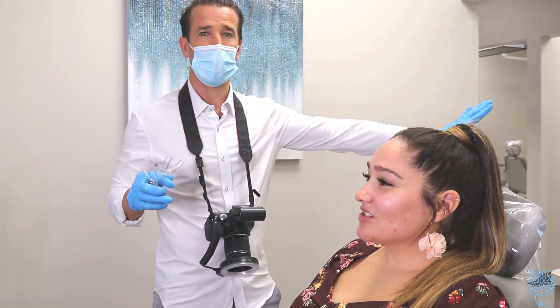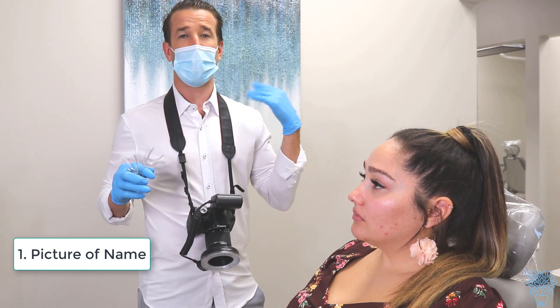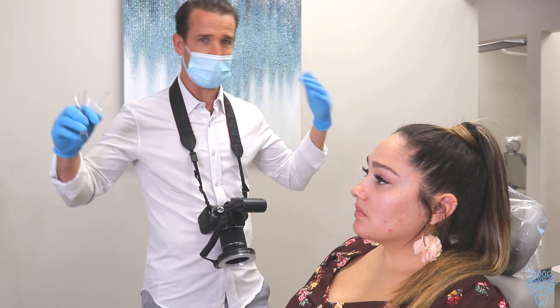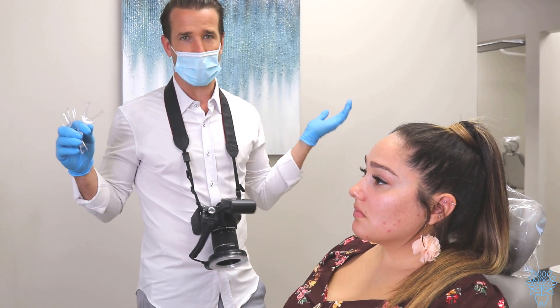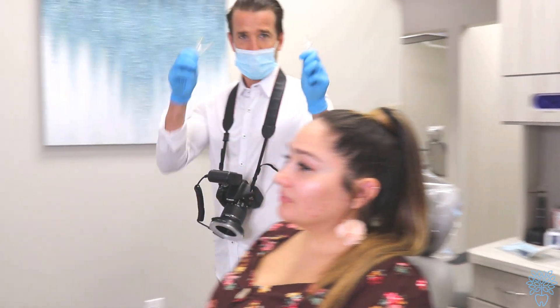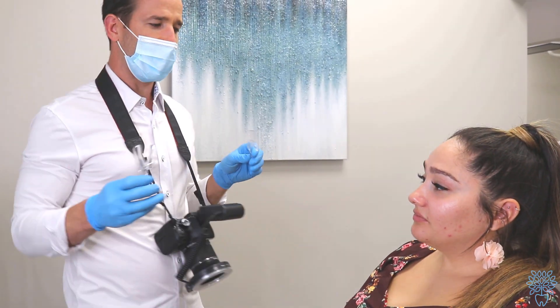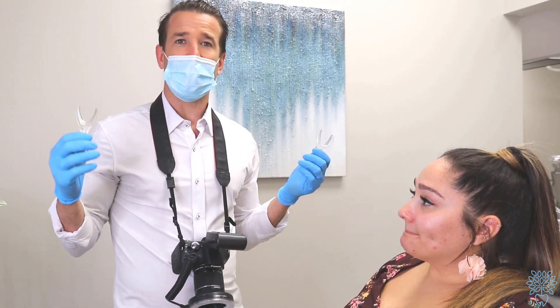If she were a patient, step number one is to take a picture of their name first, because we're going to have a lot of patients and things get mixed up. If you take a picture of their name first, everything is more organized. Click, click — take a picture of their name, and then you start using the retractors.